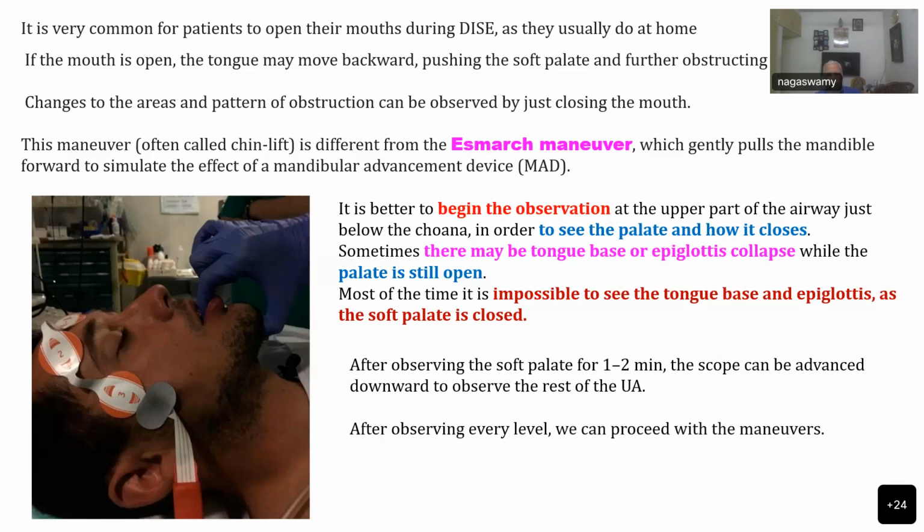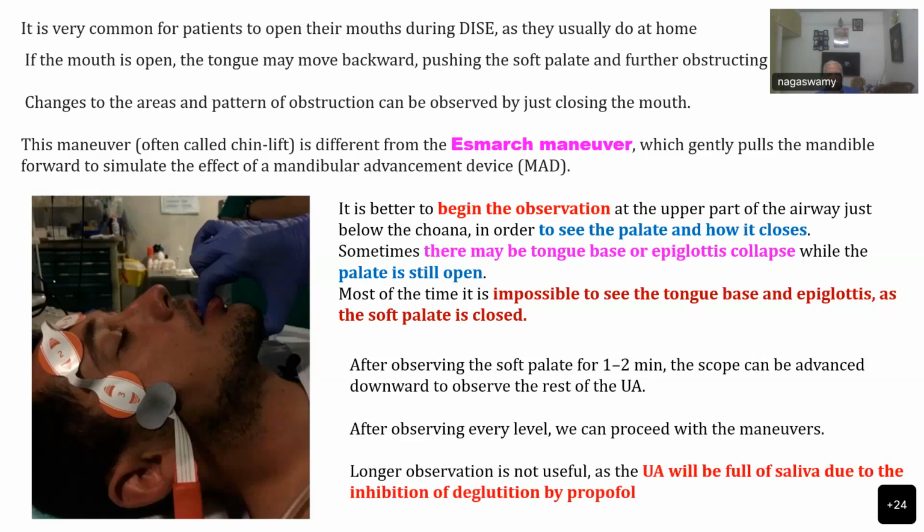And we can proceed with all these maneuvers. Taking too much time is not useful, because all these inspections can be finished in a very short time as you are entering. That is why you said the whole process can be finished within 15 to 30 minutes.